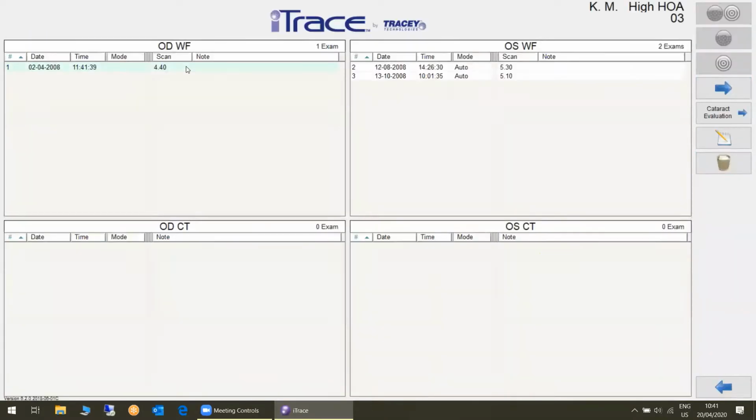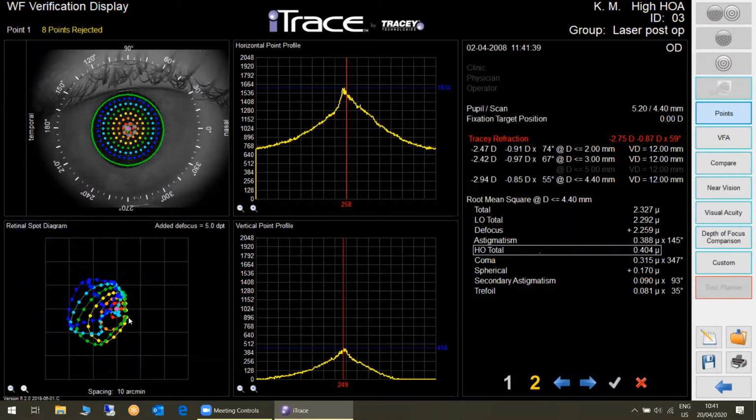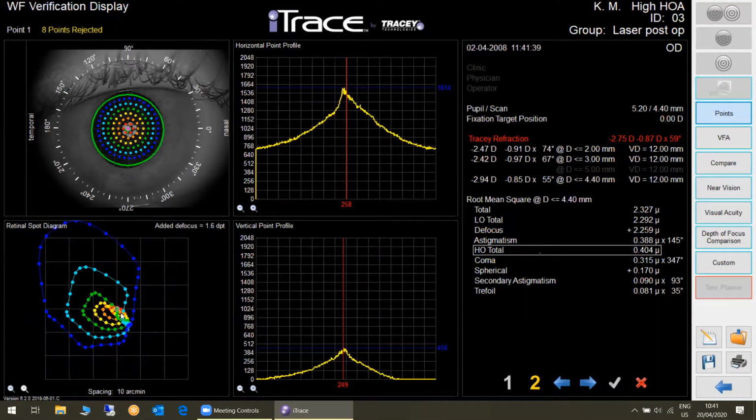And then you have people who come and they have an image like this. And you see, if we put glasses in front of them, it will never work. They will never be 1.0 or 20/20 or 100%. And this is because they have higher order aberrations.